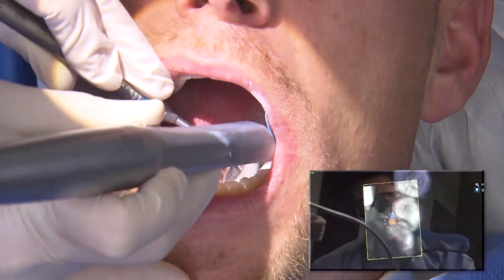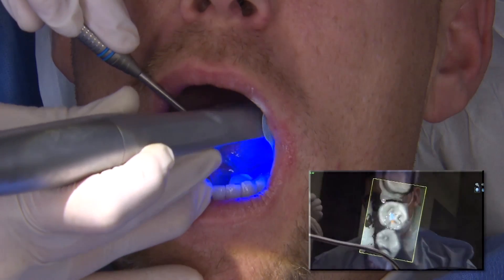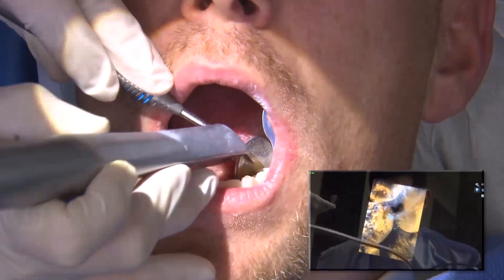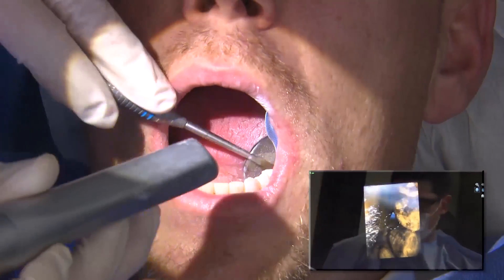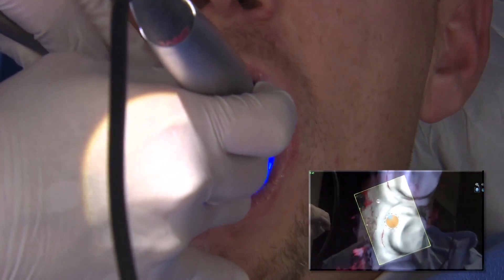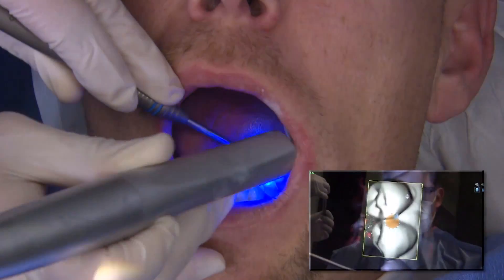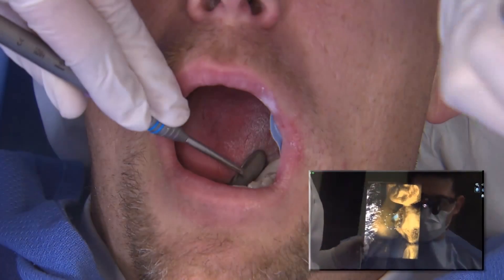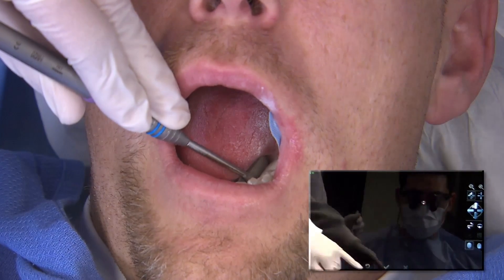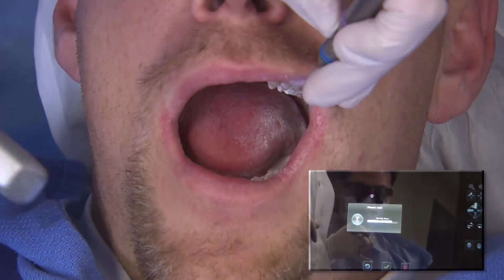Once 18 is completed, I begin moving slowly toward the mesial and ensure that I capture everything buccal, lingual, and occlusal on tooth number 19. Then I begin moving even more mesial to capture a couple of teeth toward the mesial neighbors of 18 and 19. When scanning the adjacent teeth, it's very important to also include the contact point — so the distal surface of tooth number 20 needs to be acquired as well.